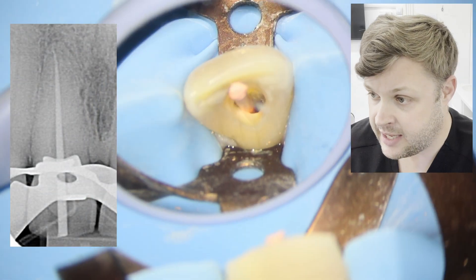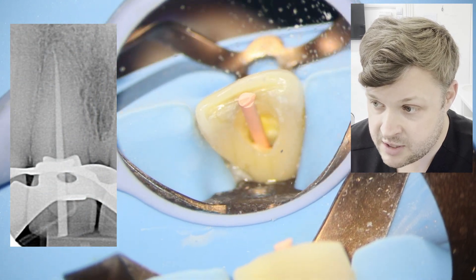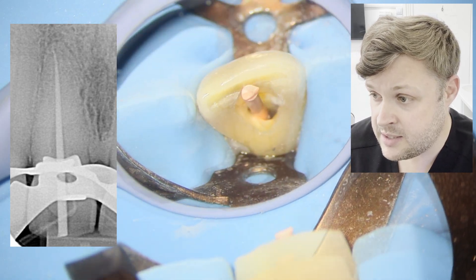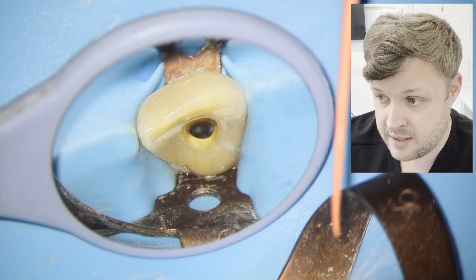This is essentially a matched cone — HyFlex 25. It's to length and it looks pretty sweet. We're going to pull that out and put it in some hypochlorite to make sure it's disinfected.